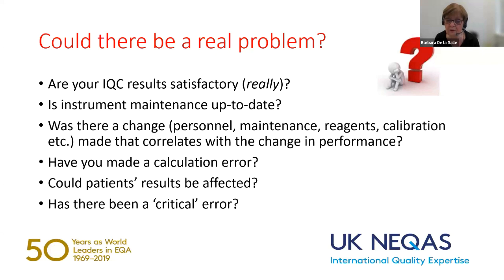So then ask yourself, could the patient's results have been affected by the changes that you've seen in the EQA, and has there been a critical error?